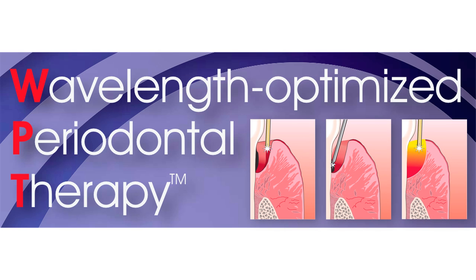Wavelength-optimized Periodontal Therapy: the minimally invasive way to treat moderate and advanced periodontal disease without flap surgery. Flapless minimally invasive surgery can be performed with the PowerLase AT to produce bone and periodontal tissue attachment and regeneration to a beautiful, healthy condition. This can be done without pain and swelling to our patients, and allows the general practitioner to keep these procedures in-house.